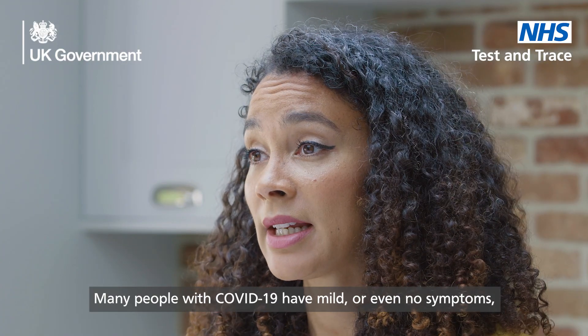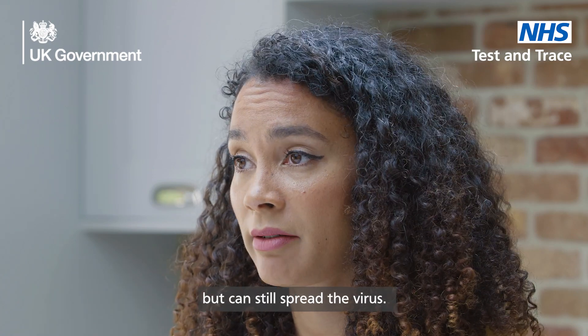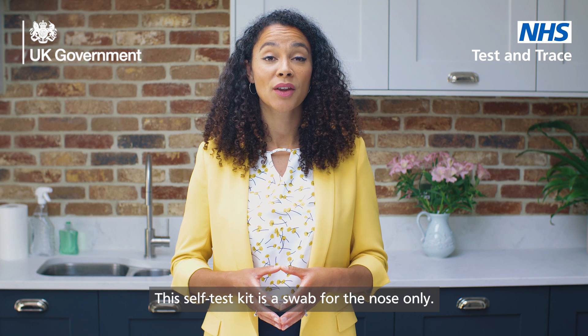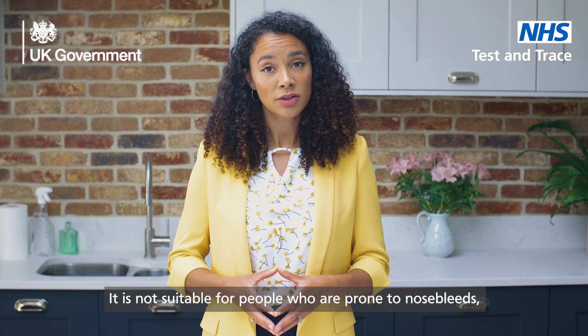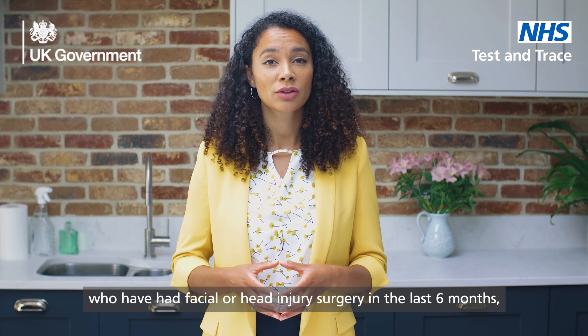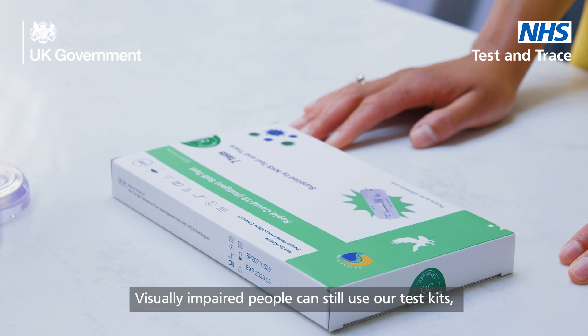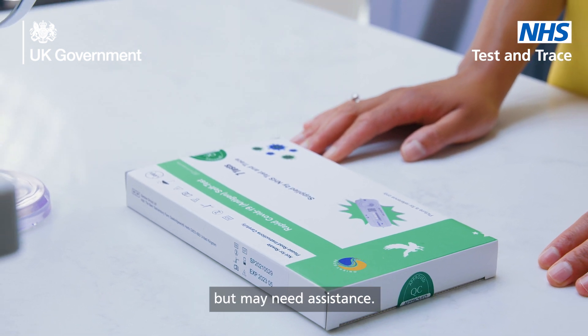Many people with COVID-19 have mild or even no symptoms but can still spread the virus. This self-test kit is a swab for the nose only. It is not suitable for people who are prone to nosebleeds, who have had facial or head injury surgery in the last six months. Visually impaired people can still use our test kits but may need assistance.